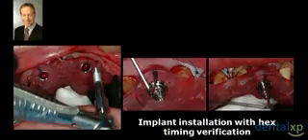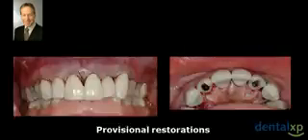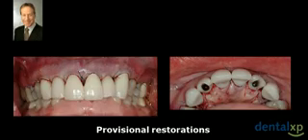Remember, the provisional restorations were completed. And here we are now at the completion of surgery with 2 screw-retained provisionals in this area, which is my preference to avoid cement sepsis and contamination. So, minimally invasive? Yes, because it was the least amount of treatment to get the maximum result under control for this particular patient. Was I nervous about this patient's deep overbite?